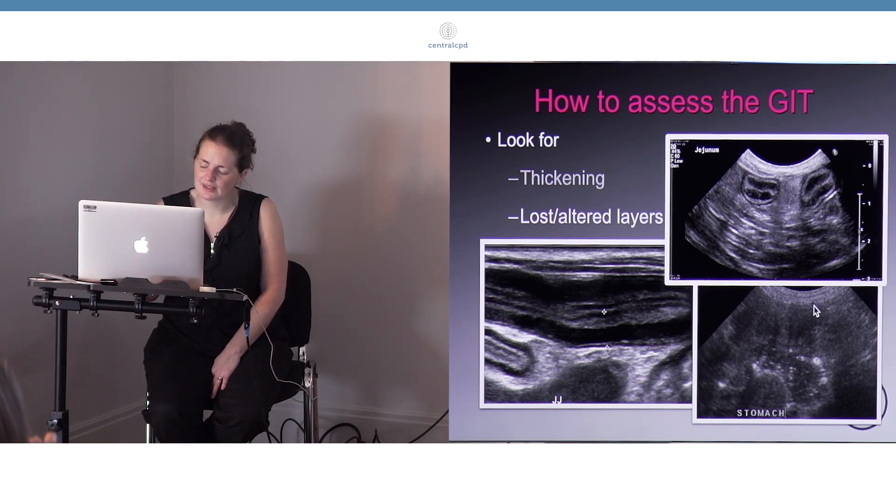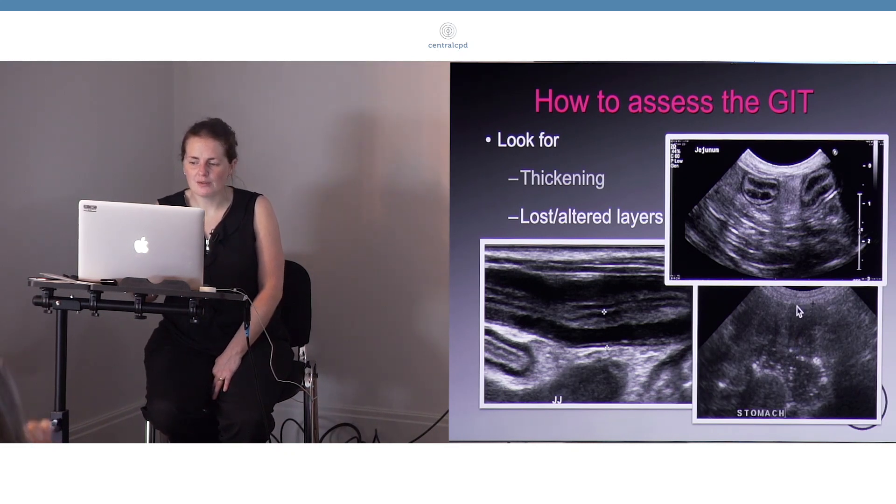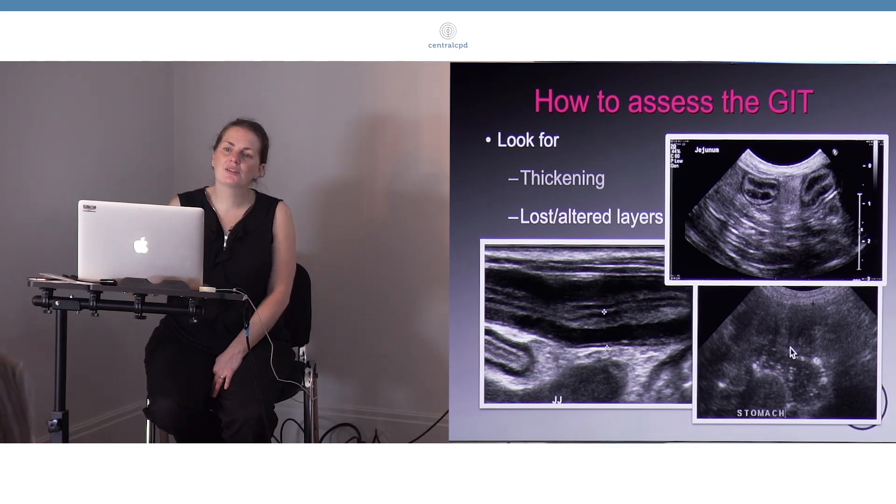This is stomach for sure. This is thickened, but also there is no normal layering present. So the complete loss of layering is something that is very suggestive of some kind of infiltrative disease.